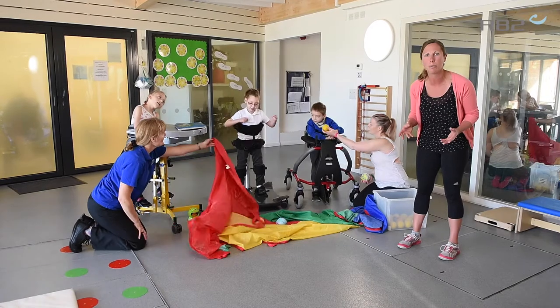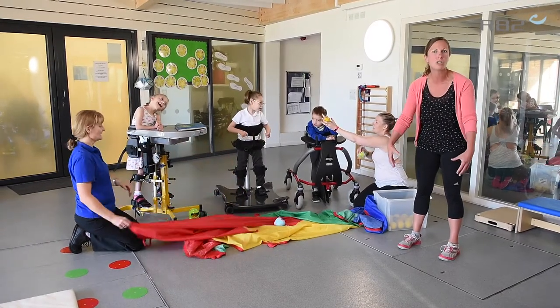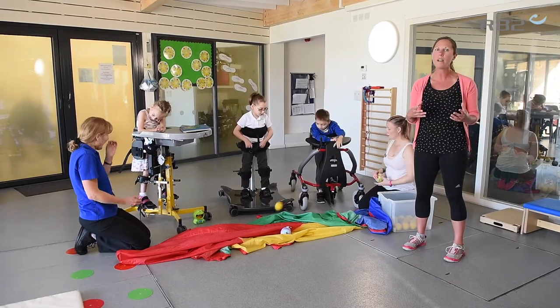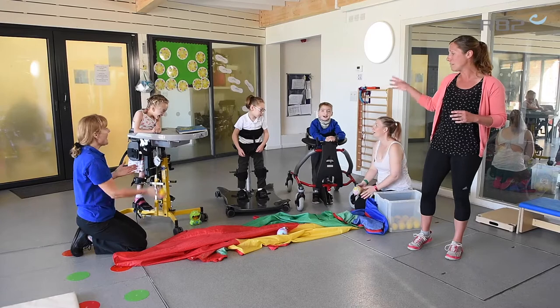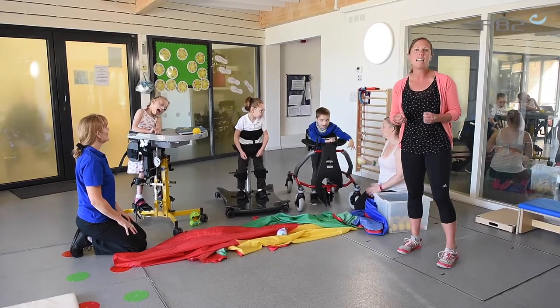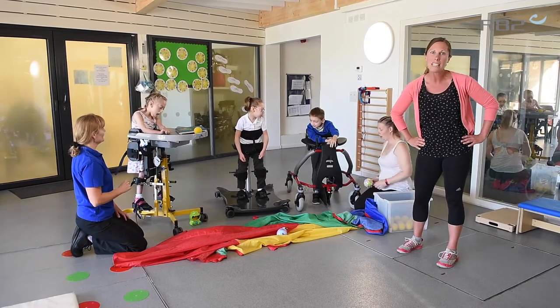However, that's such a big jump — a big jump from having all those body alignment positions supported statically to all of a sudden having much less support in that Mustang, and actually asking the child to coordinate their movements while they step and control that body. And that's where the Meerkat comes in and bridges that gap, because it allows us to align the body position but fits at the point of instability of the child.